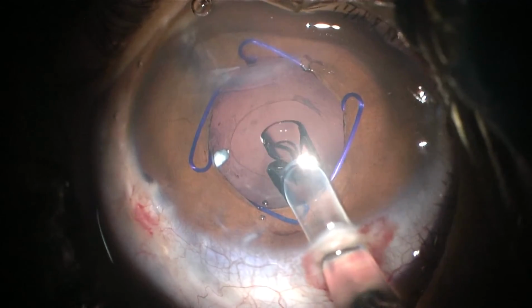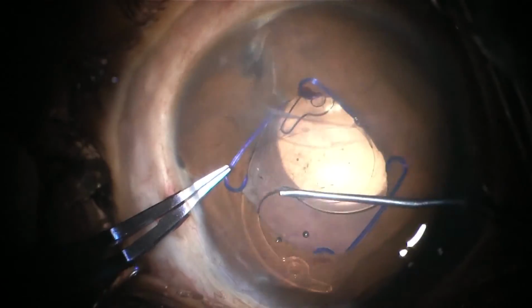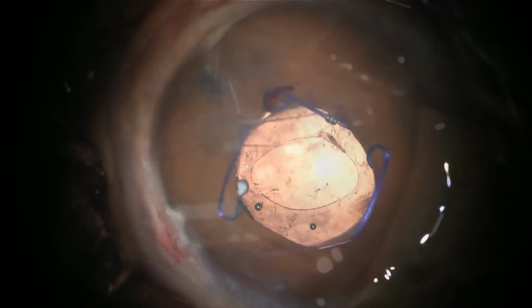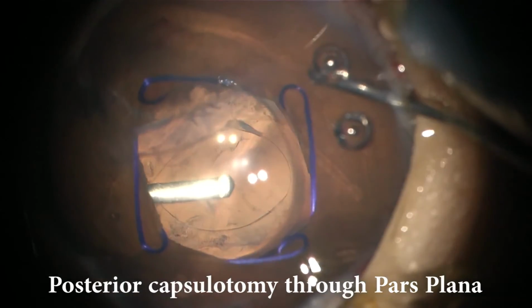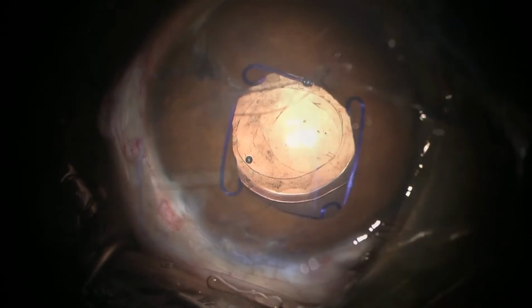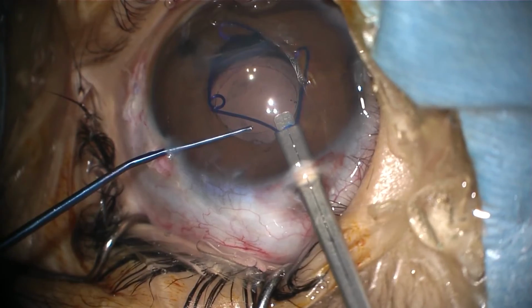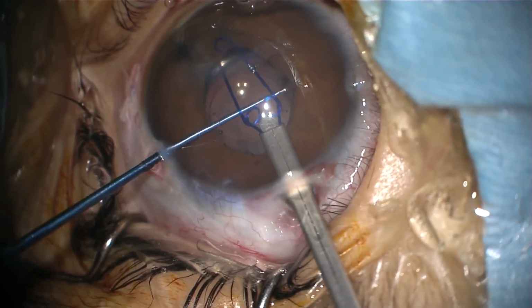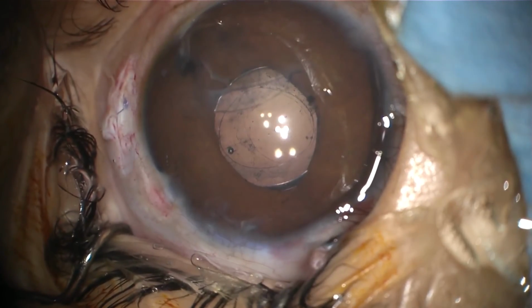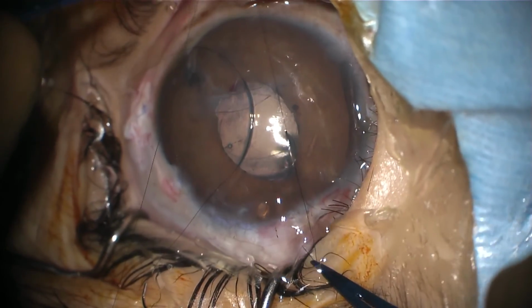The IOL was then loaded into an injector and injected in the capsular bag. The trailing haptic was slid into the bag to achieve stable central placement of the IOL. An adequate size posterior capsulotomy was done via the pars plana approach using a vitrector. A well-placed IOL with anterior and posterior capsulotomies can be seen here. Viscoelastic was removed from the anterior chamber and the ports were sutured to conclude the surgery.